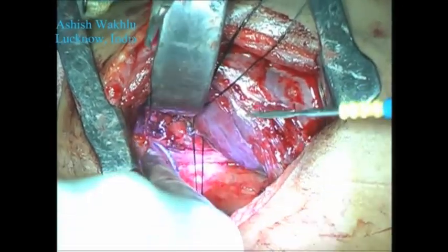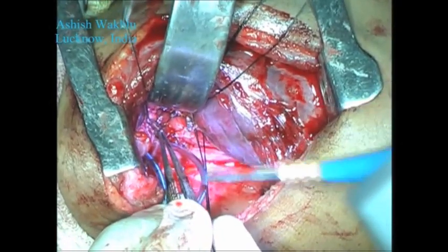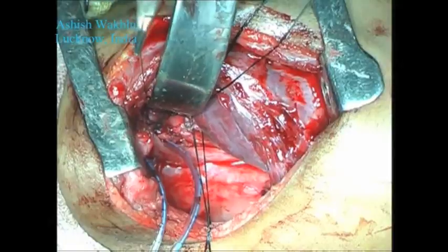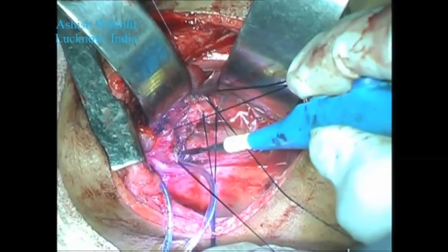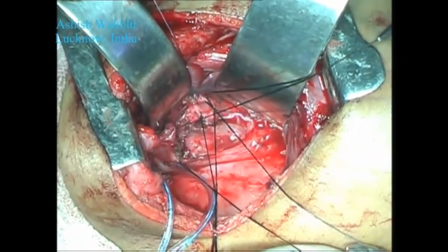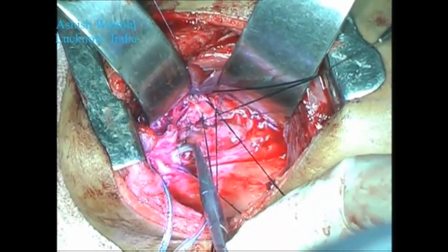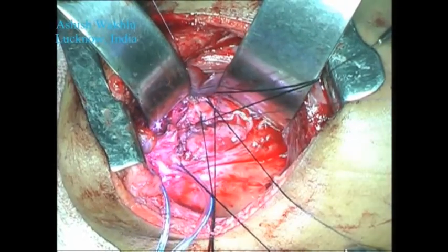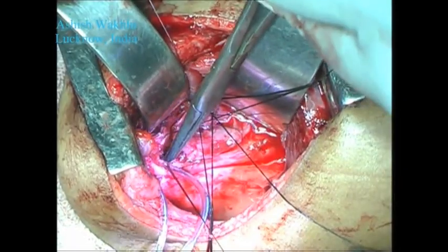As you can see, the stump of the right bronchus is not very long, and it is densely encased in fibrous tissue, which has to be carefully cleaned away, otherwise it is liable to constrict the anastomosis subsequently. We are opening the stump transversely, as the pulmonary hilum goes from above downwards, and there you can see the Rumel's artery forceps entering the lumen and a little bubble of air coming from the stump.